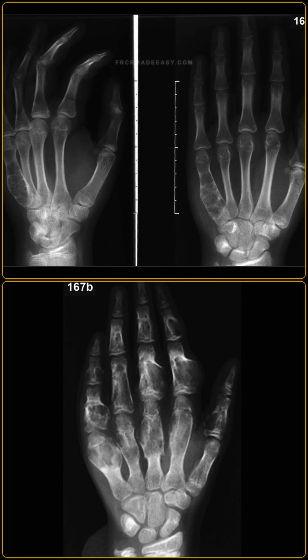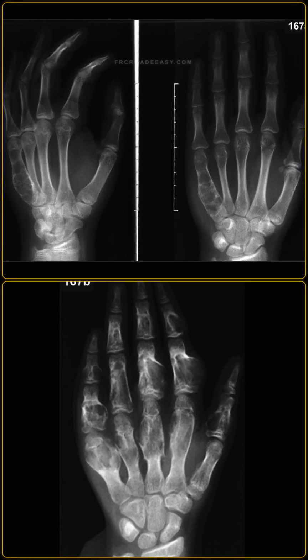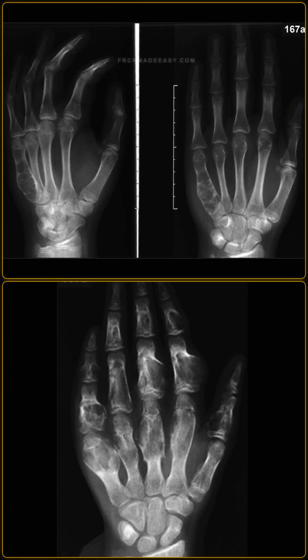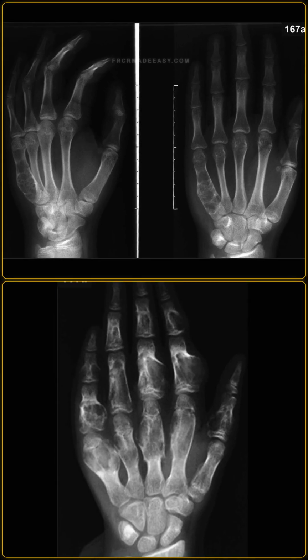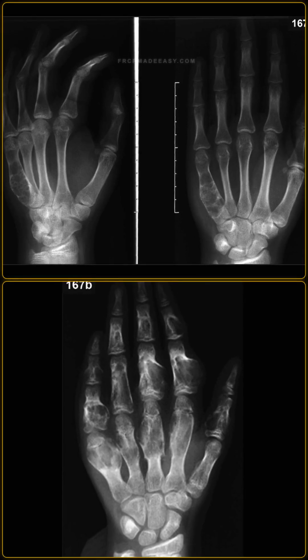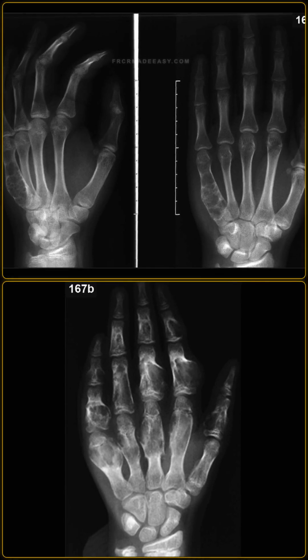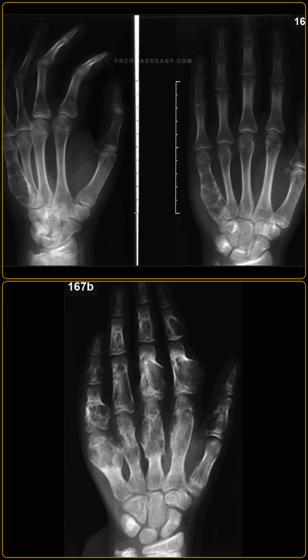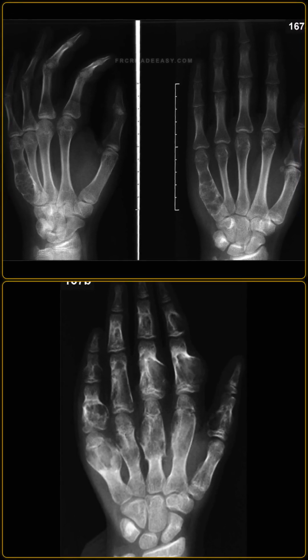How would you manage this patient as a radiologist? As a radiologist, I would recommend comparing this hand film with prior studies if available to confirm stability. I would suggest obtaining a complete skeletal survey or radiographs of the opposite hand and long bones to evaluate for multiplicity. If the patient reports localized pain at the lesion site without an acute fracture, I would recommend a contrast-enhanced MRI to evaluate for endosteal scalloping and cortical breach.